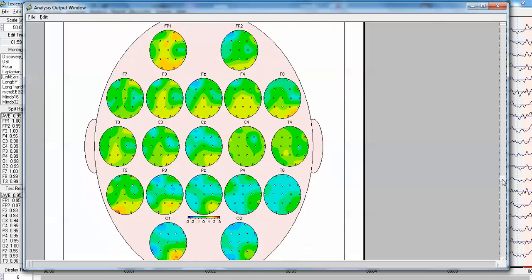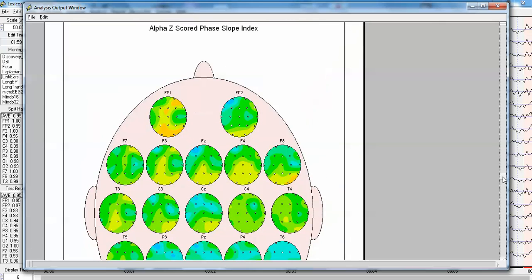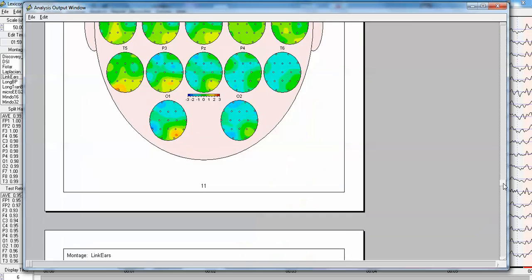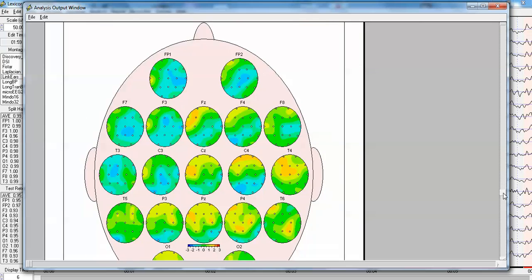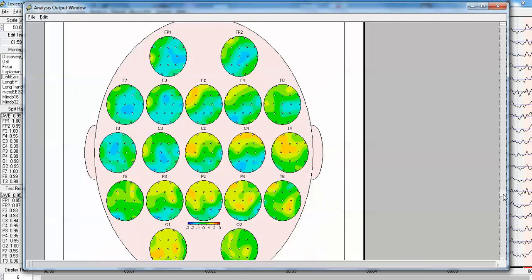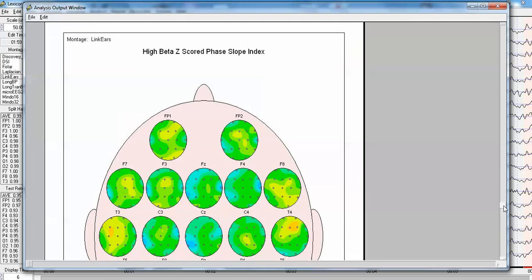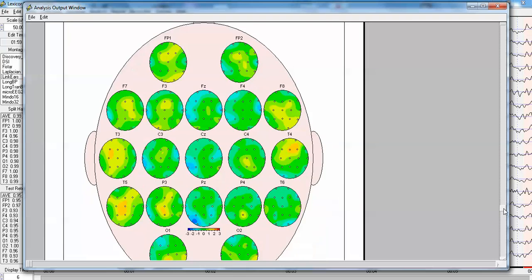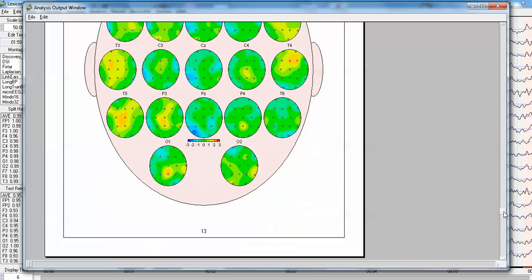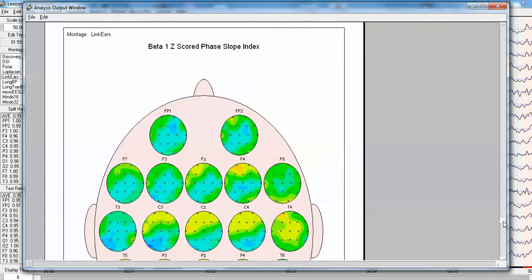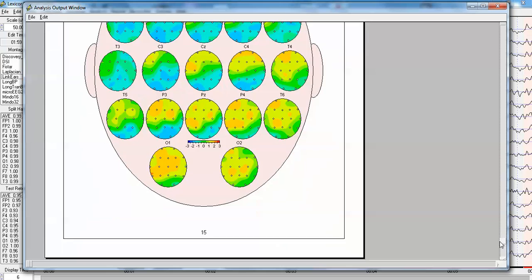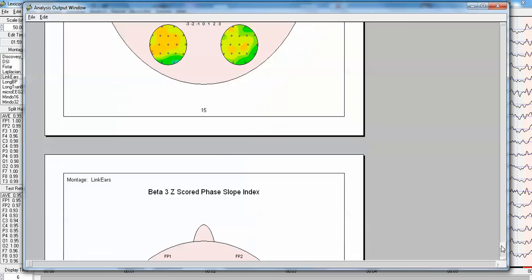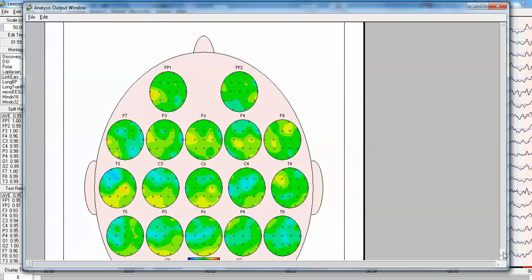If we come down here, you can see the alpha is fairly normal, and you'll see that Z scores are fairly normal at higher frequencies, including the beta. The primary deviation from normal is in the theta band.